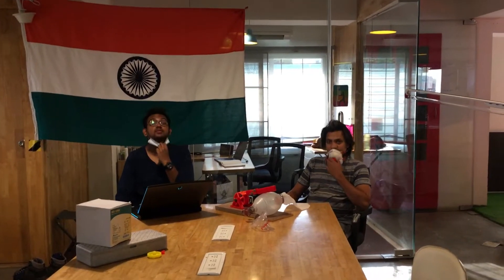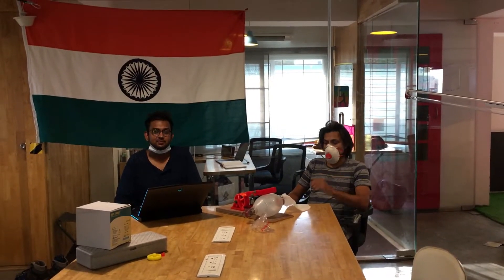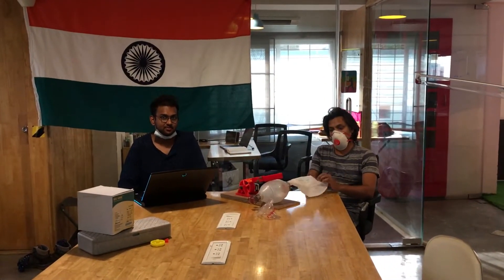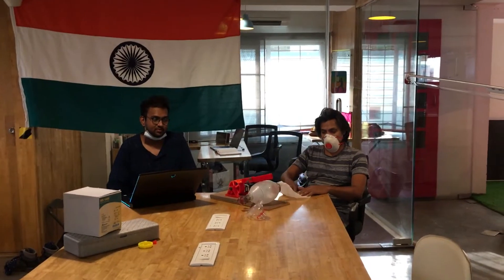Vishnu, Santosh, and Nikhil at the EcoCreate lab in the Lahaila building with the first prototype of the sub-10K ventilator.